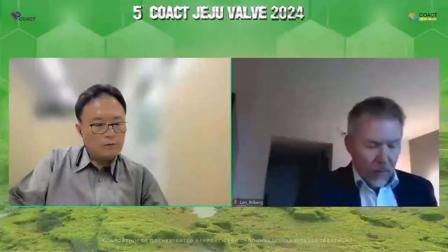Thank you very much for the great question. I also think it is very important. In the Japanese situation, some doctors try to adjust commissural alignment in Navitor as well as the Evolut system, but many doctors say that it seems impossible.